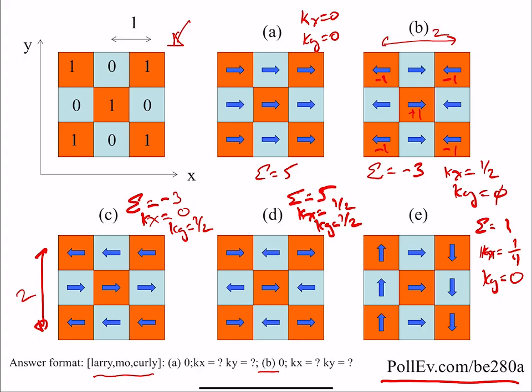So if we see something that has a period of 2, we can't really determine whether it's plus or minus. That means that normally the Fourier space is just double represented for kx equals 1/2 and -1/2. The idea is, depending on what your resolution is, there's this uncertainty at the edges of k-space. So in fact, you don't actually have to acquire that extra line.